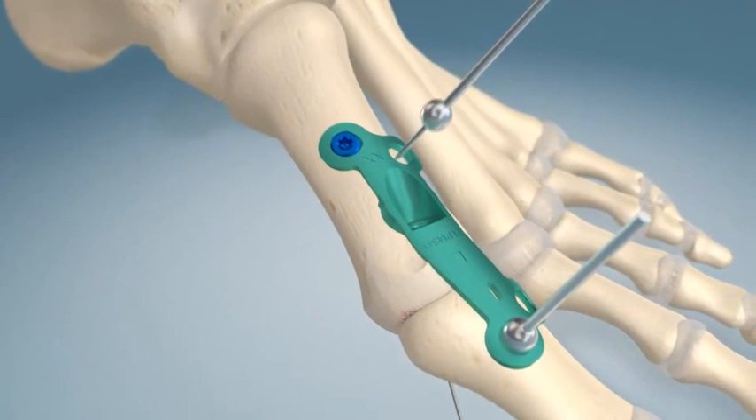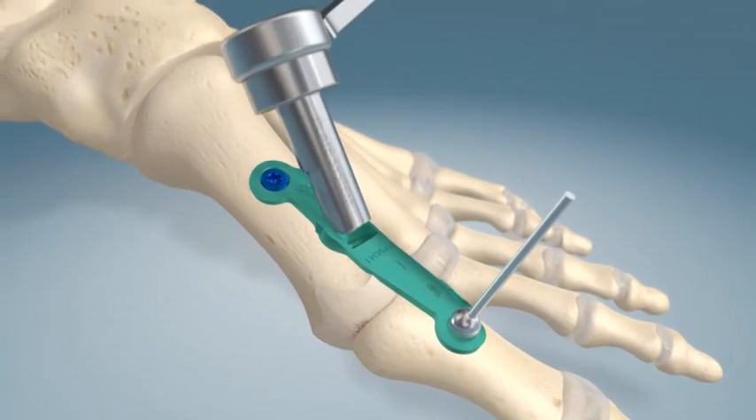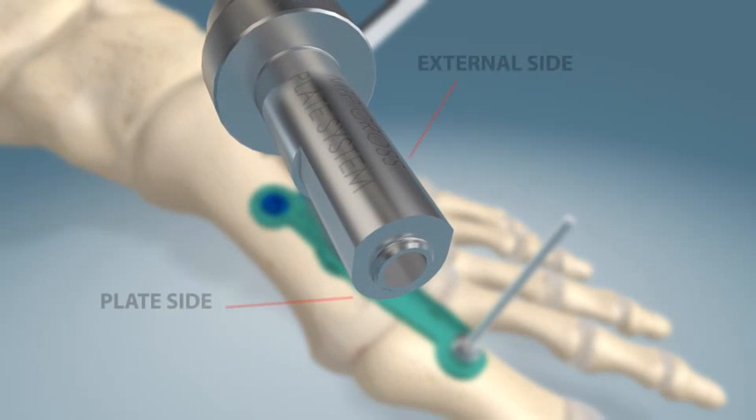Once fixated proximally, the cross joint drill guide is positioned and reamed using the anchorage specific reamers provided in the system. Note: proper placement of the guide is necessary to ensure correct alignment of the plate, plate side towards plate.